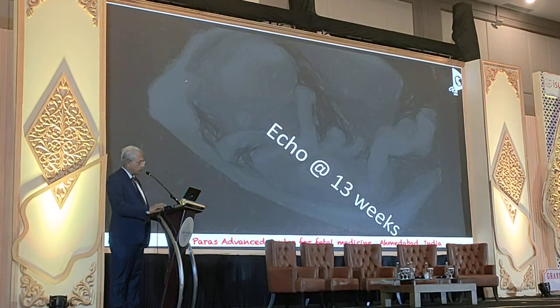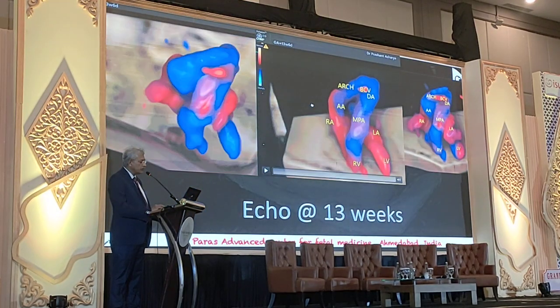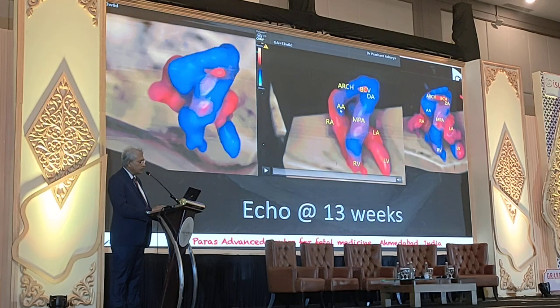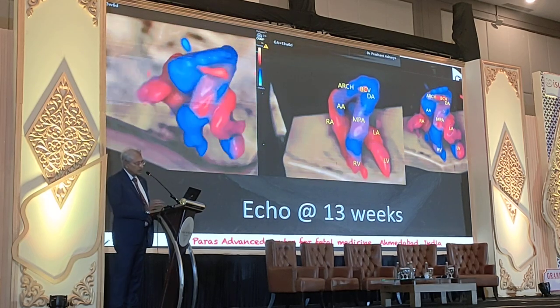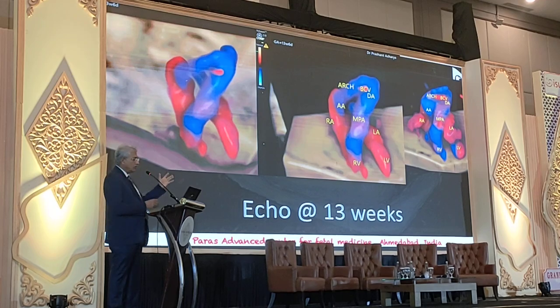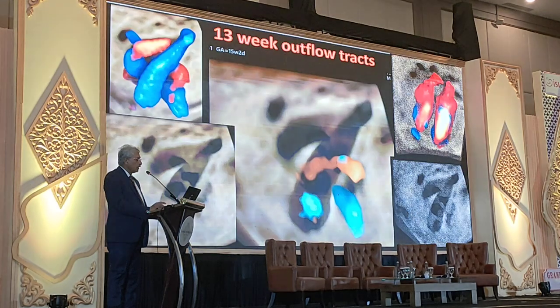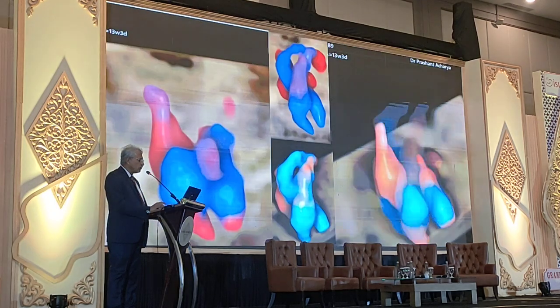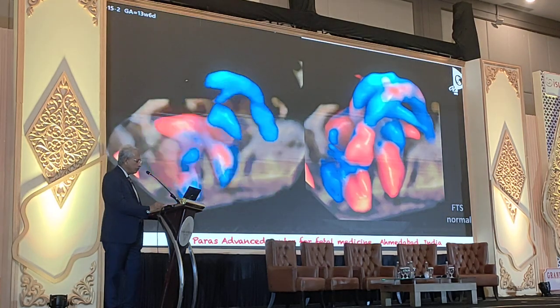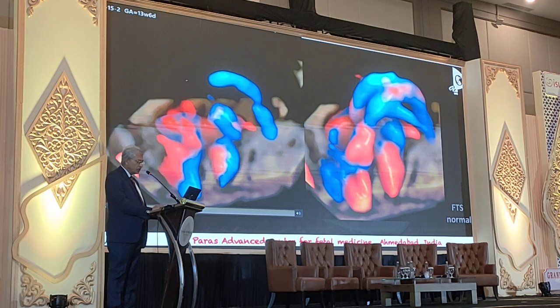Trying to show you, let me annotate everything. This is the left ventricle, left atrium, right ventricle, main pulmonary artery, ascending aorta. You have arch, brachiocephalic vein, and this is during diastole, and this is during the systole. You can see everything right there in the first trimester. There is again a 13-weeker heart, and I think you should be able to look at whatever details you want, we can have those details which can be really visible during that first trimester of the heart.